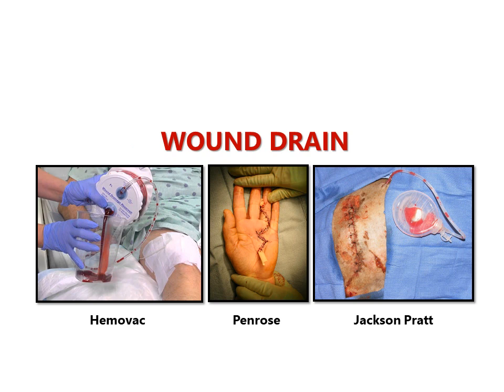As mentioned earlier, part of your assessment is to check for wound drainage or wound drain. Wound drains are devices that are attached adjacent to the wound. Okay? And these three are the common wound drains that you would observe if your patient has a wound. Why is it that the patient has a wound drain? As mentioned earlier, a normal wound produces a fluid we call exudate. However, a large amount of exudate will cause delay of wound healing. That's why we put a wound drain in order to drain body fluid, blood, etc.